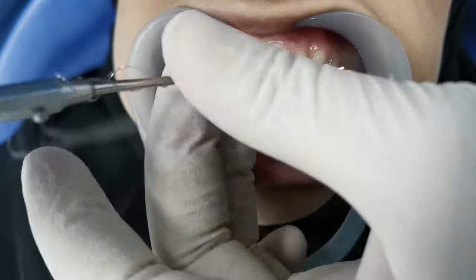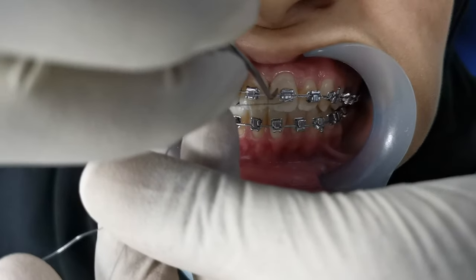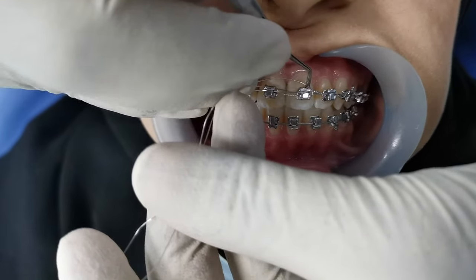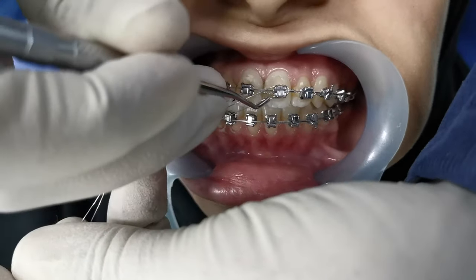Cover until the inter-bracket span. By this way I will go one by one tooth based on my treatment plan. This is how we do the continuous ligation.